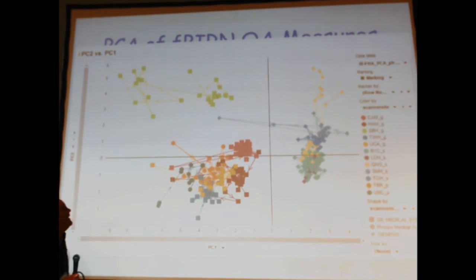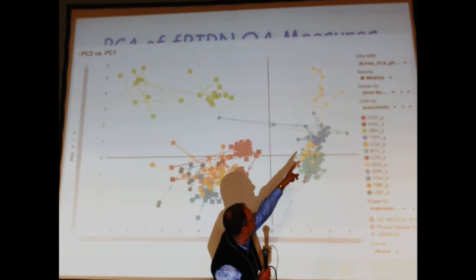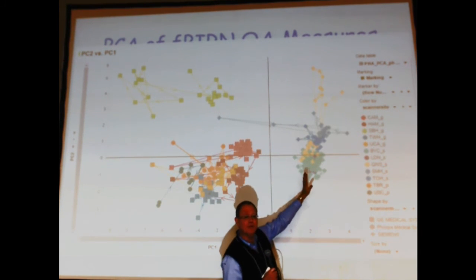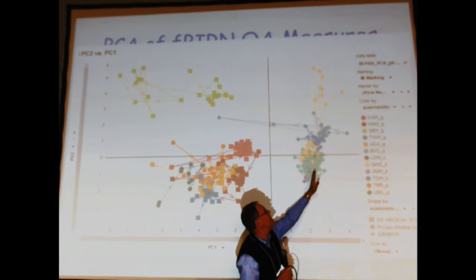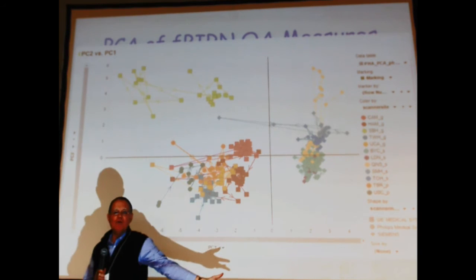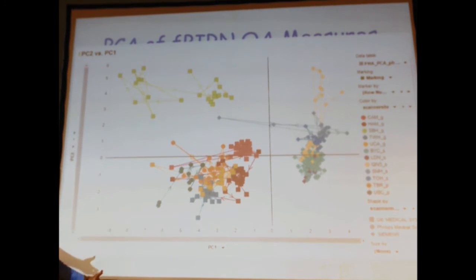I don't quite know why. And that's also a GE at the top there. This is a scanner that had purely a ghosting problem. It stayed at exactly the same resolution, and that turned out to be about a 200 hertz change in the pixel bandwidth, which took quite a while to sort out.